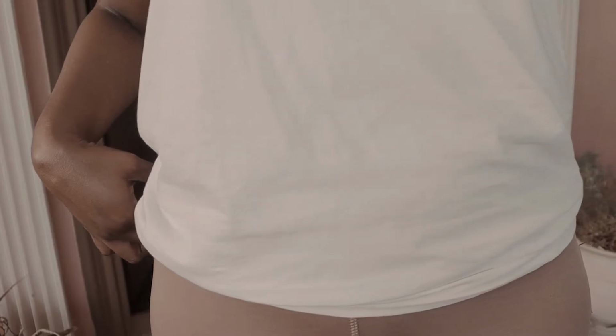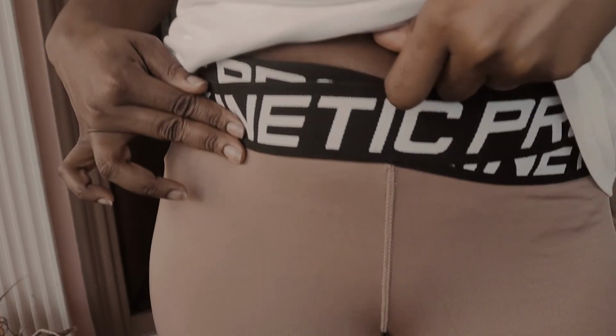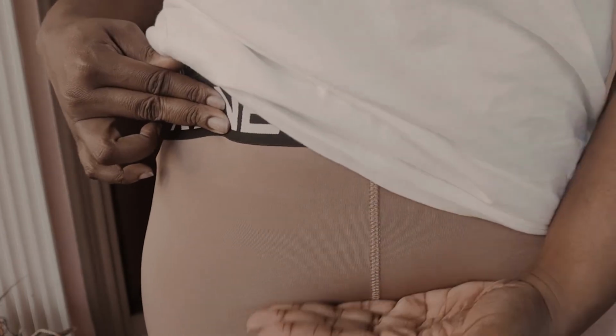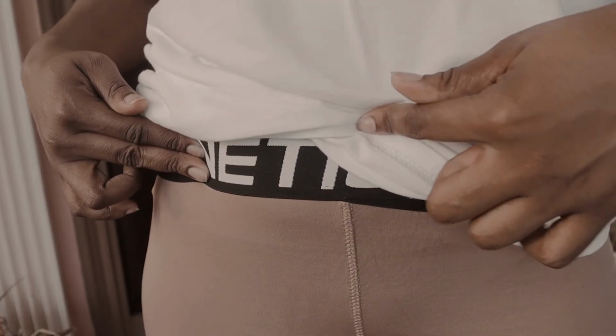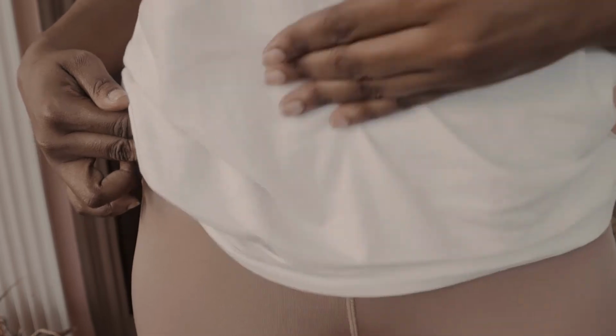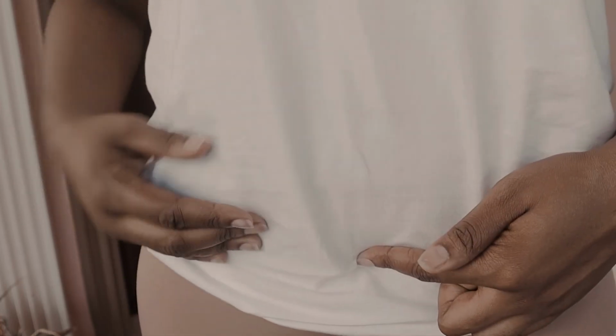Showing my demonstration from my hip, and this is so awkward because children are passing. Right, so you have the ASIS here, you have the symph here, which is palpable. Draw an imaginary line across here, which is right below the navel most times. Here, and this is the midline, this is the centering for the hip.